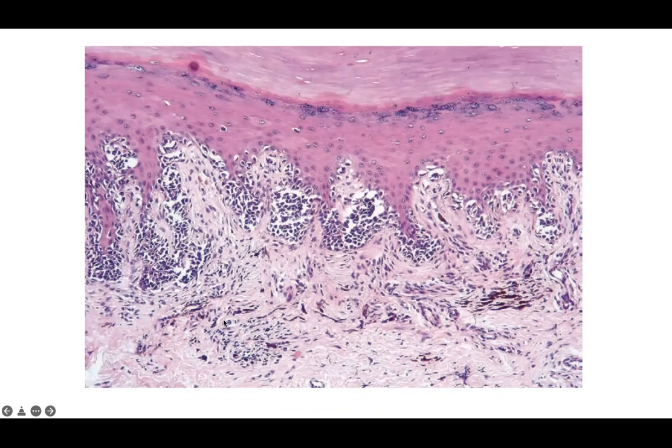In the dermis, it's difficult to see, do you have some atypical melanoma cells in the dermis or not, or is this just mainly some type of fibrosis happening with proliferation of vessels? So I would do a SOX stain and a PRAME stain just to look and see if any of these dermal cells are positive, because this proliferation is clearly away from the plane of the rete ridge here. So this would be invasive if these turned out to be SOX positive. If they were SOX negative, then this would just be a very prominent melanoma in situ that's not invasive, of acral lentiginous melanoma.